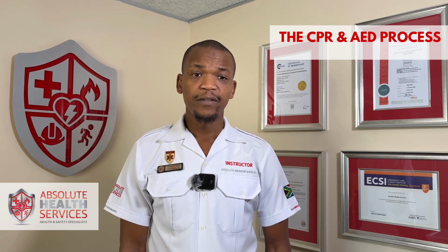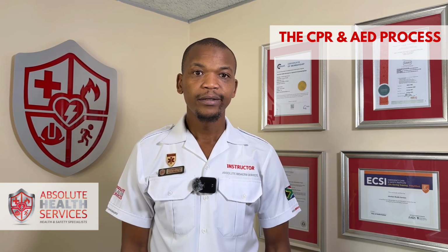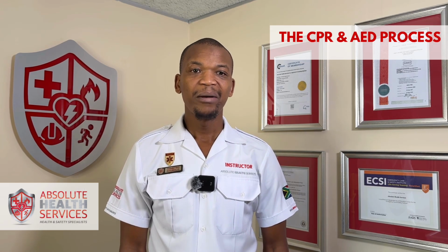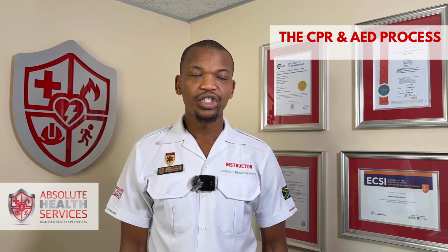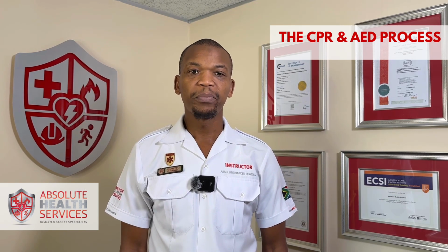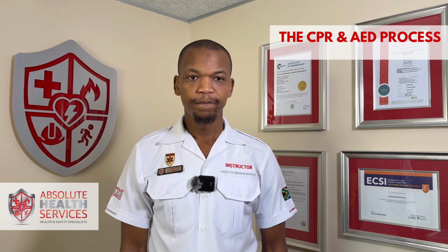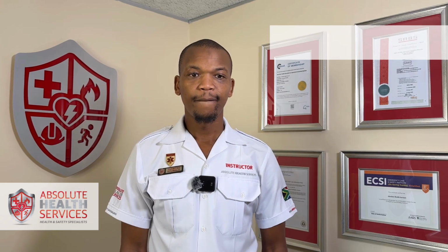After the shock has been delivered, which will be instructed by the AED, you will then continue with your CPR. Mainly, the AED increases the chances of survival of the patient by delivering an electrical shock, which will then be followed by performing CPR.